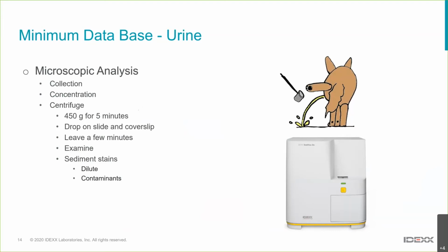Cocci can be a little harder because other things like debris and bubbles can sometimes look like cocci. There were some studies done a few years ago looking at cats and dogs, comparing what we call a wet preparation, so just looking at the urine sediment, comparing if you thought you saw bacteria on that, how many positive cultures, how many negative cultures did you get with that?